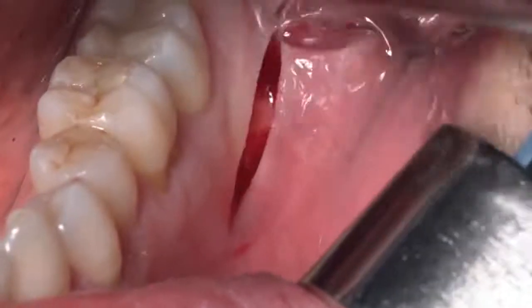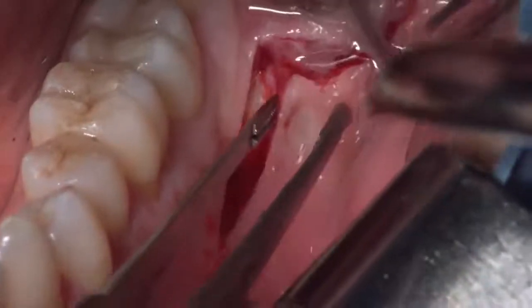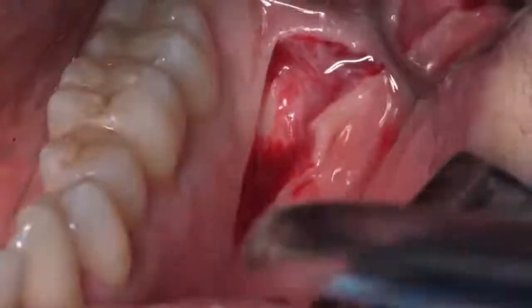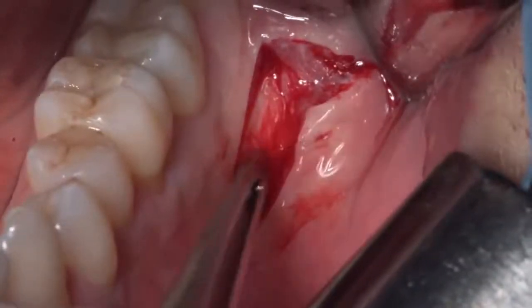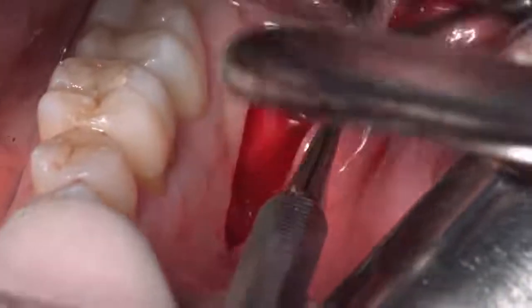Then we have to start the vertical distal incision. It is an oblique vertical incision that goes toward the distal. It is a very shallow incision because we want to cut only the mucous membrane and not the underlying muscles. You can see that the muscles have not been cut.